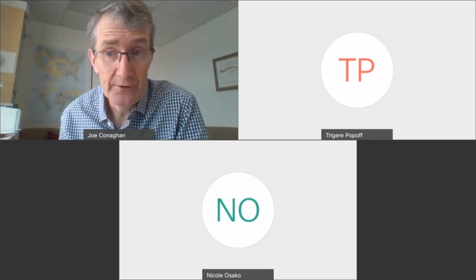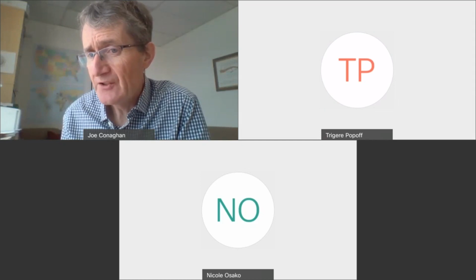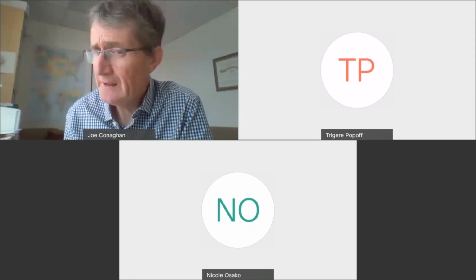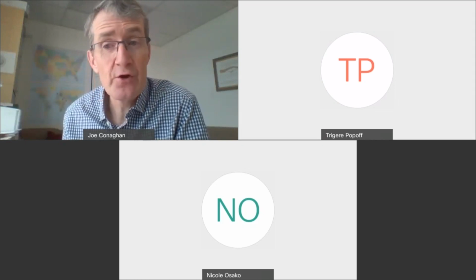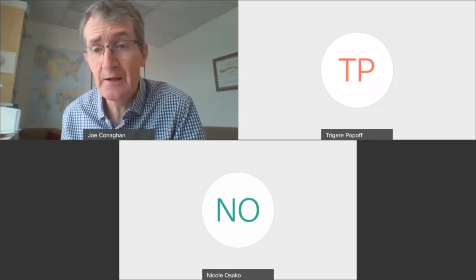It's a lot. And we're also using cryoprotectants that are good glass-forming agents that vitrify very easily. So you have something like DMSO that forms the glass very readily, and you don't tend to see cryoprotectants like glycerol in vitrification solutions because glycerol does not form a glass very easily, or at least doesn't form a glass as easily as DMSO.